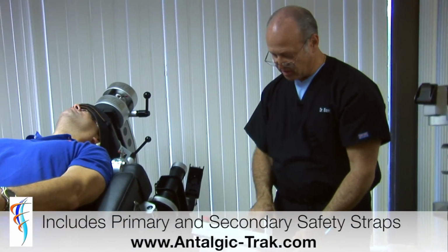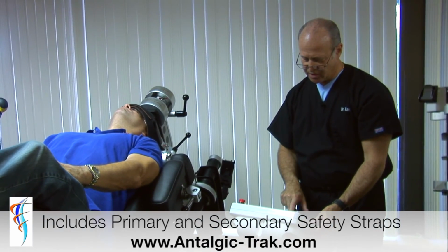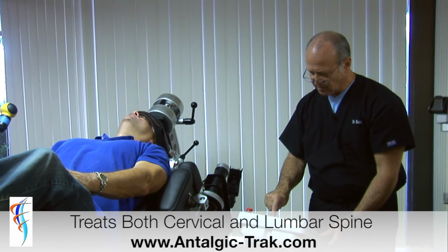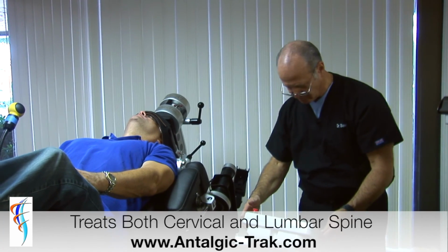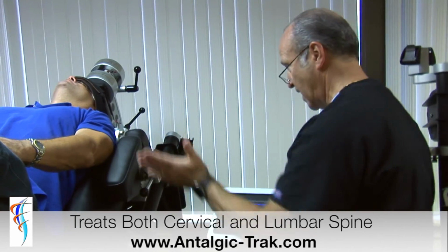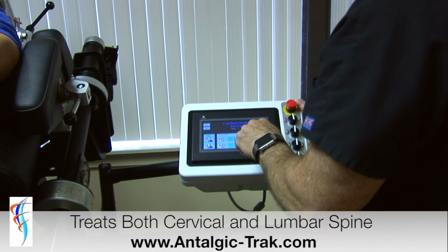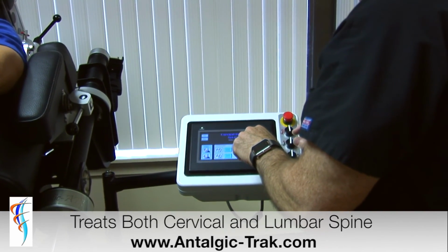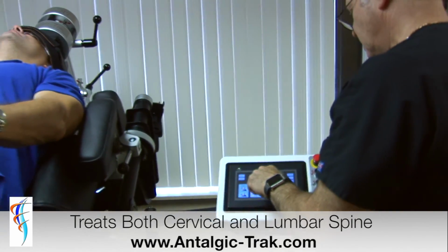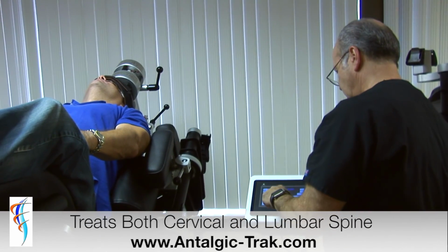I go once again to my touch screen. I go into my cervical therapy selection. I'm going to set it up with a distance setting. I'm clearing out my last session. And I'm going to now raise the headpiece. And we see we have a poundage reading. I'm going to raise a drop more. And I'm going to teach that amount of pull. Then I'm going to release and teach.